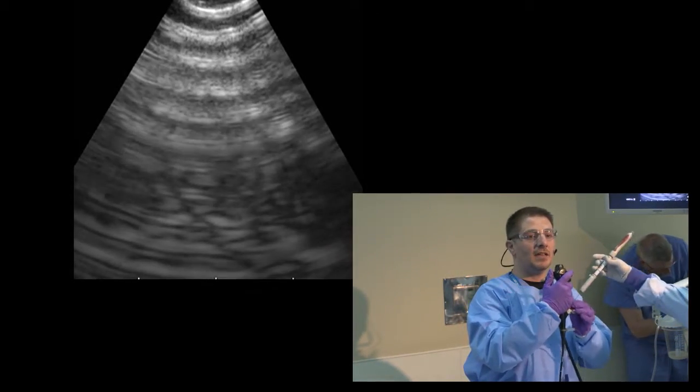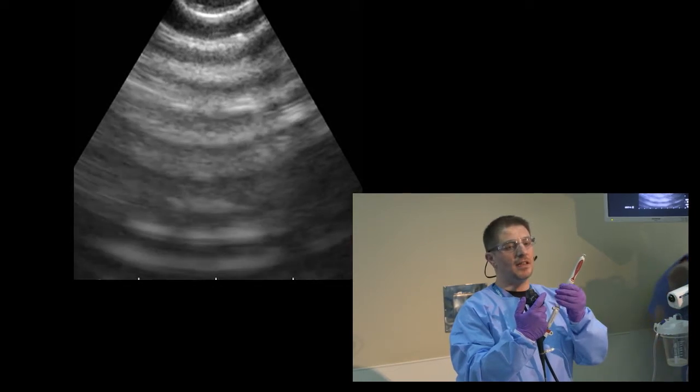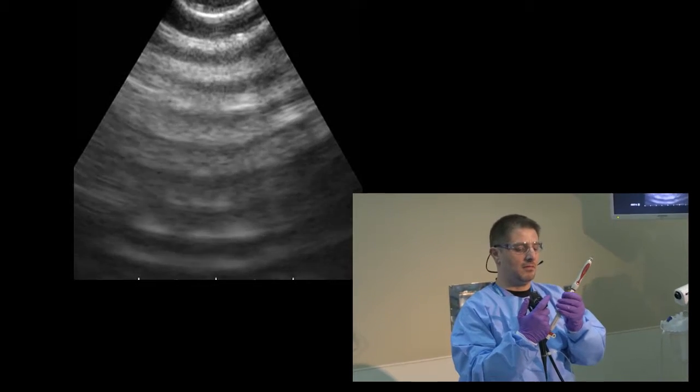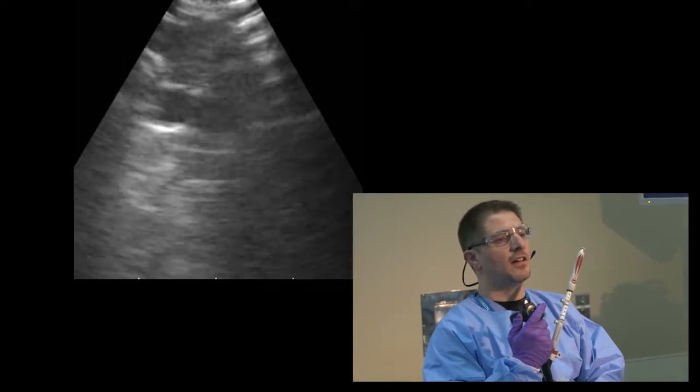We're using 22 gauge needle. The most important part when you set up the needle is to keep your eye on the endobronchial view to guarantee the sheath is coming out of the scope, as you see here. And then you lock the sheath at that level. You set up the depth of the penetration, usually at 2 centimeters. And then you find your target again.